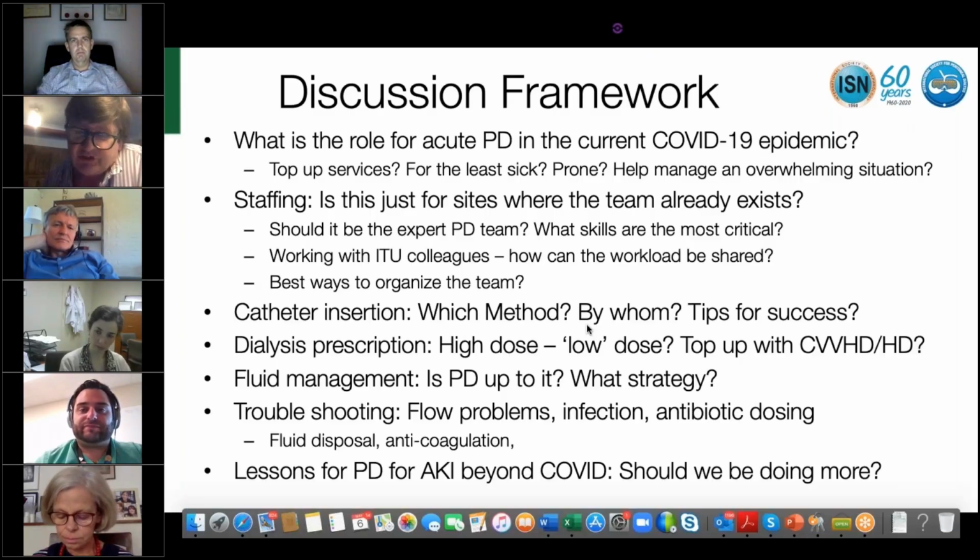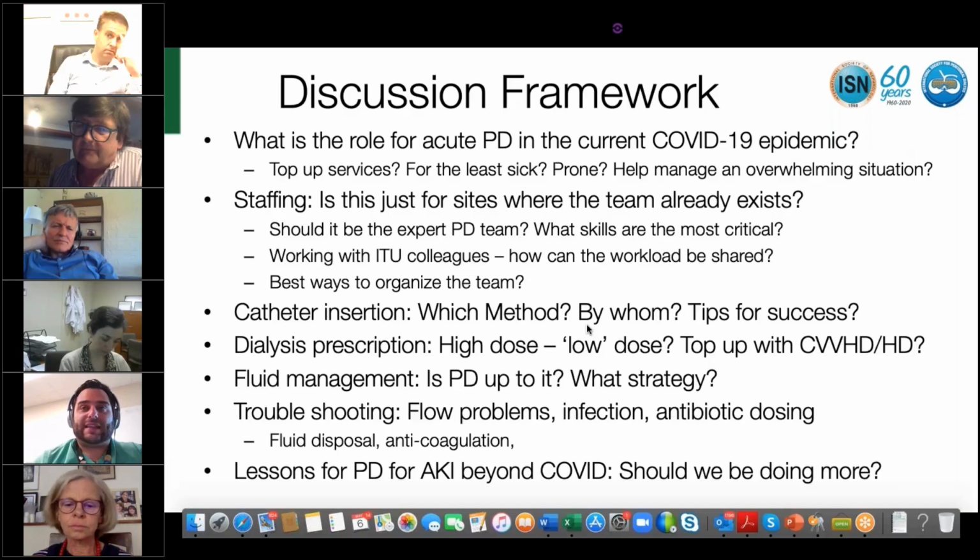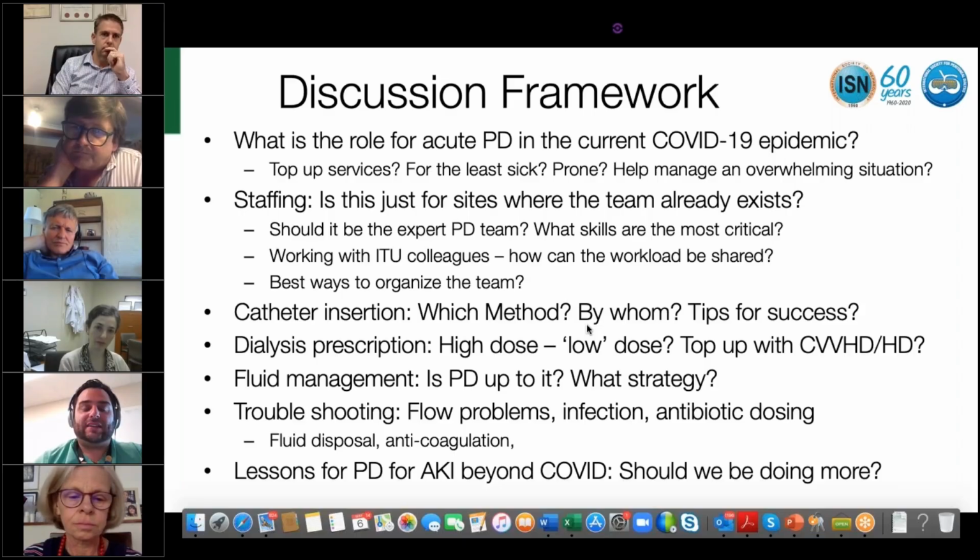And did you ever get a situation where you were transferring patients from hemo to PD? Yes, actually, not so much from the hemo specifically, but it was particularly from CRRT. We were having so many issues with clotting of the filters that some patients, we just could not maintain them even on prolonged intermittent renal replacement therapy, 8-10 hours, despite heparinization, they still kept clotting the filters. Those patients actually turned out to be great candidates for PD. We would put heparin in the bags and they ran beautifully. We found that the catheters worked really, really well, surprisingly.